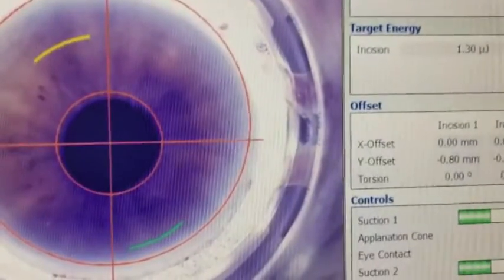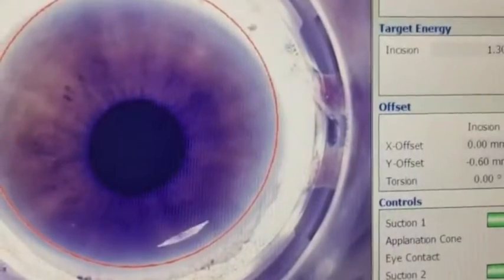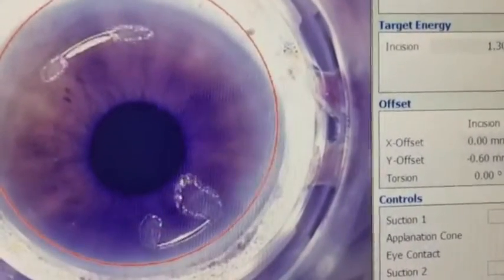Here I'm using the latest laser technology, the WaveLight Laser, to safely create accurate laser incisions to fully correct astigmatism.